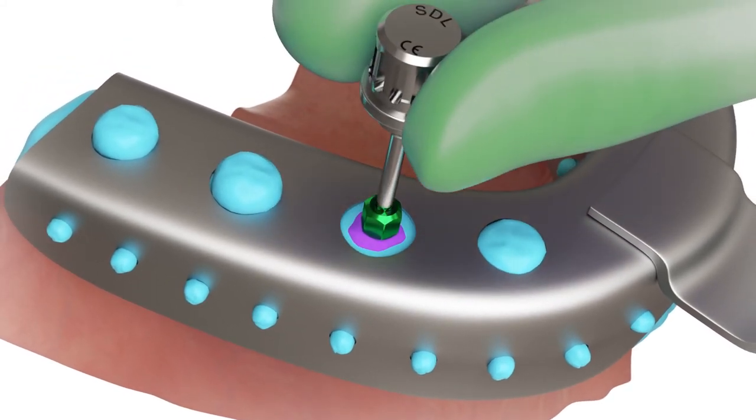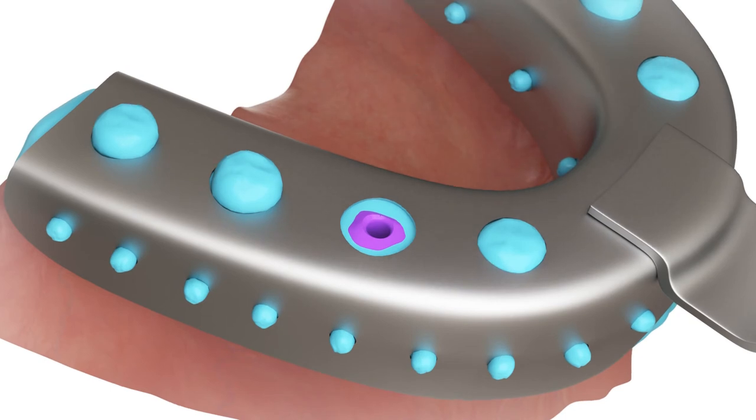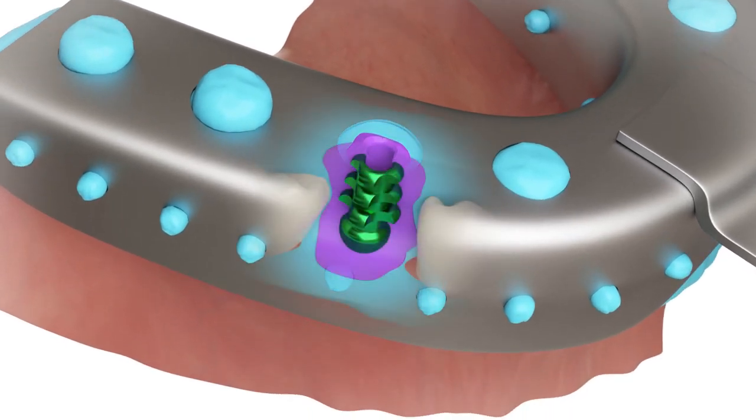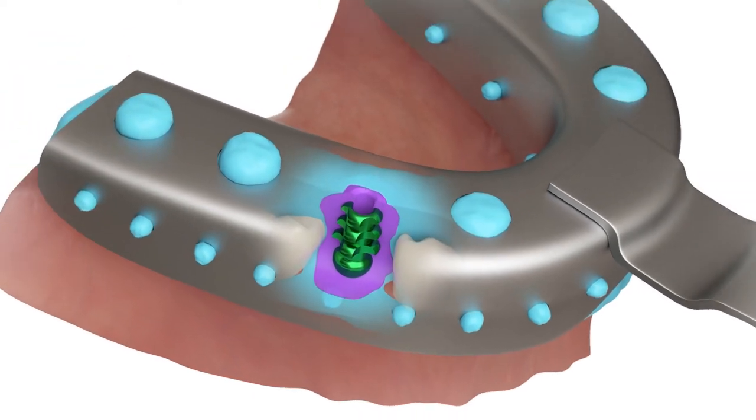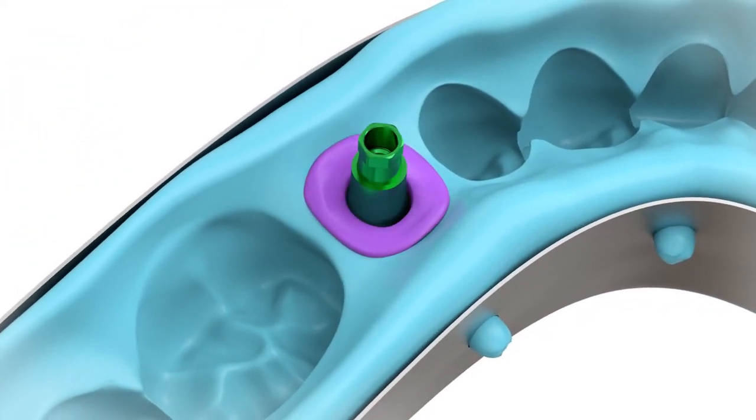After the impression, dry unscrew the screw and remove the impression. Leave the transfer in the dental impression.